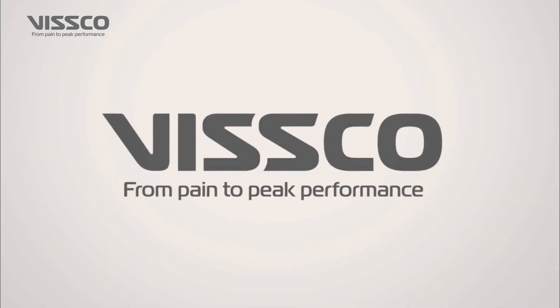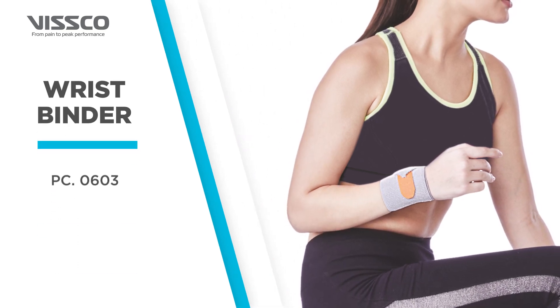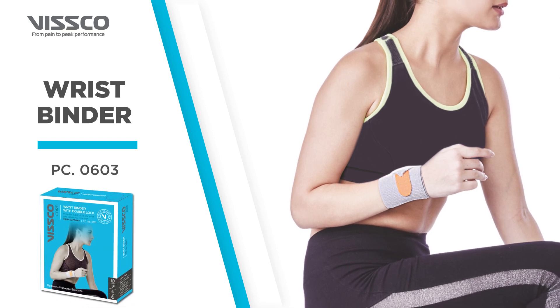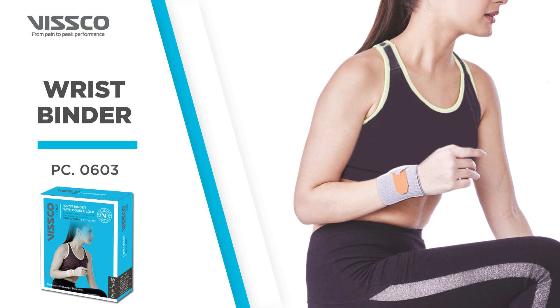Greetings from Wisco. Let us now see the Wisco Wrist Binder with Double Lock, Product Code 0603. The Wisco Wrist Binder supports the wrist muscles and relieves pain to keep you in action.